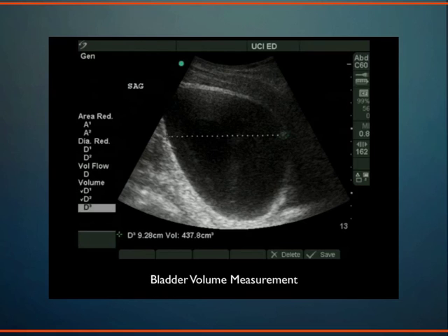It's something that we want to know about actually quite frequently in the hospital, at all ages. In little babies who have a fever, we want to basically cannulate their bladder, put a catheter into their bladder to get the urine out, to send it off for urine culture. Well, some of them just urinated in their diaper, and you would unnecessarily put them through the procedure of a bladder catheterization, which is painful. So you could avoid it; you have to wait until the bladder fills up, basically. So I train my nurses to do this, and they take a peek at the bladder before they bother putting a catheter into a small child.